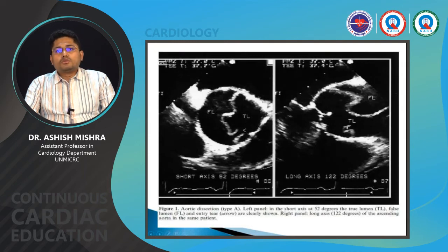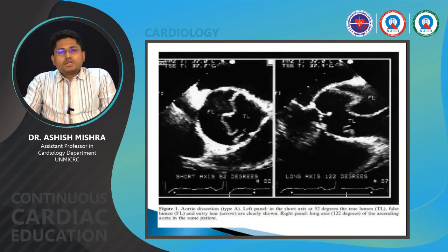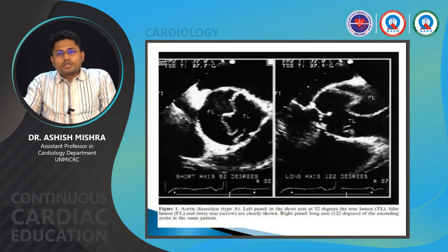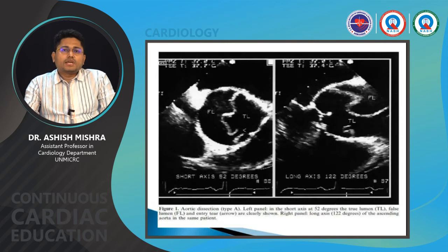This is the longitudinal profile, or the long axis profile, for the same. So again, in a patient where CT imaging is contraindicated, who may have underlying nephropathy or acute renal shutdown, and there is suspected aortic pathology, in some select cases transesophageal screening for the various aortic pathologies can be taken up.